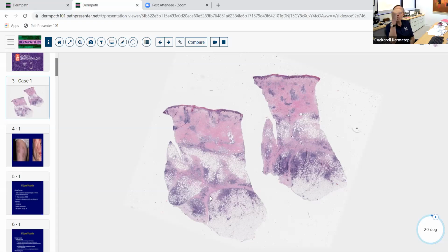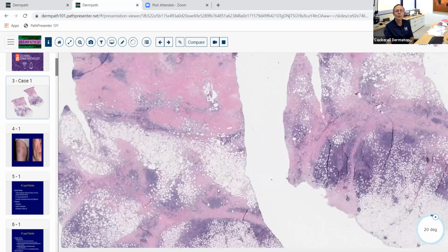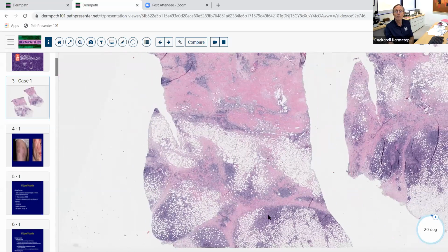And then is there anything in the dermis overlying? So you say, okay, it looks like it's a paniculitis, but is it also paniculitis and a dermatitis? So those are all the things we want to ask. And then as we go to higher magnification, we want to apply those various things. And as we go to higher magnification, you can see even at low power, you say, well, these are probably going to be mostly lymphocytes because they're dark and black.